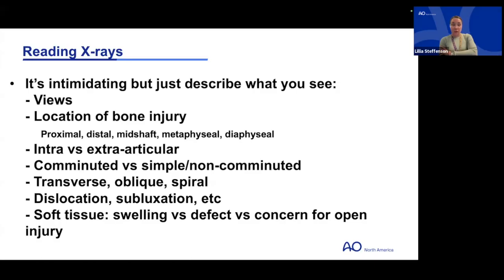Yeah, so when I'm first interpreting a series of radiographs, I'm taking into consideration which views have been provided. Additional views might be a benefit for interpretation. And then I start down this list in this agreed upon organization and how we communicate about radiographs or fractures. So, what are the views that have been provided?